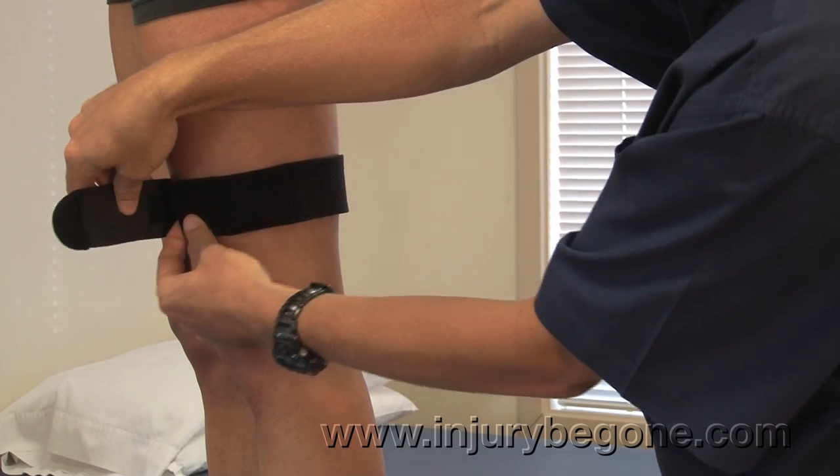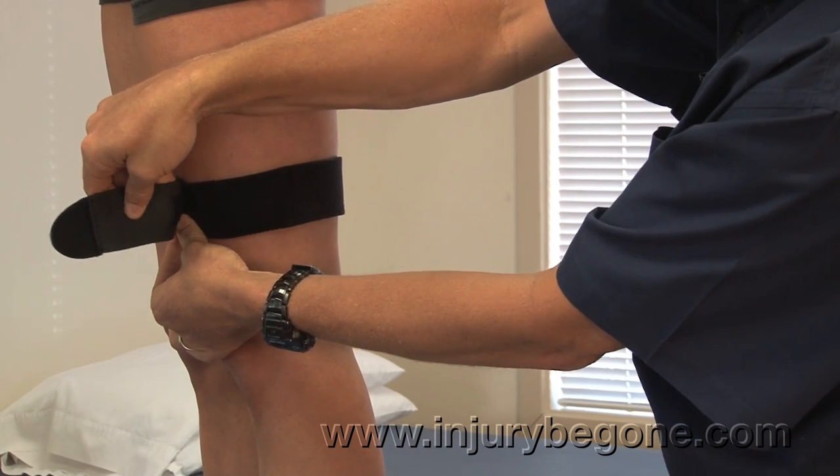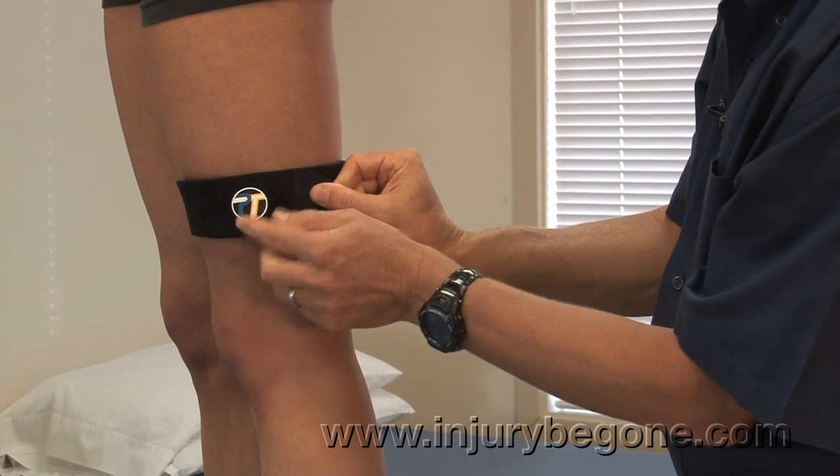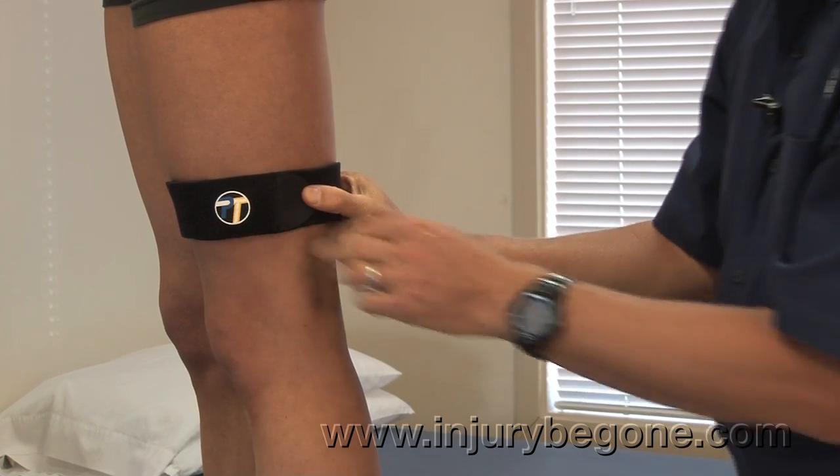We're going to wrap it fairly tight and attach the Velcro square, and then provide an additional stretch over the pad and attach the Velcro.